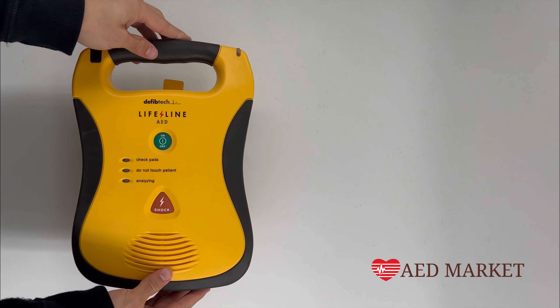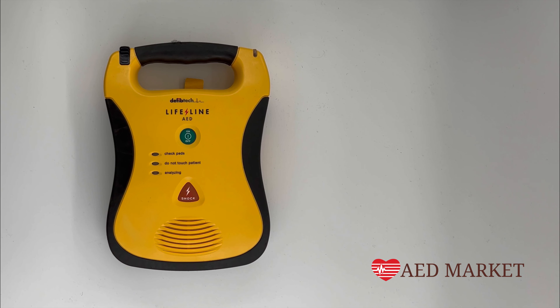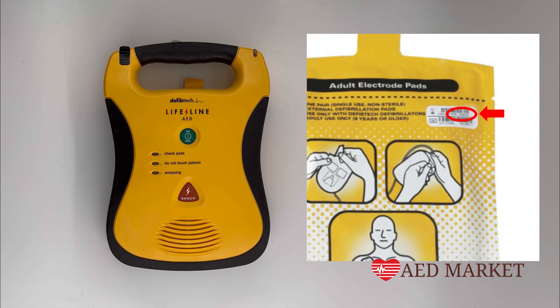To ensure you're always prepared for emergencies, it's important to keep the electrodes connected to your AED unit at all times. These pads have a two-year expiration date. To find this date, flip the device over and look at the date on the outside of the package. You're going to want to change the pads at the time of expiration or if you use the AED.